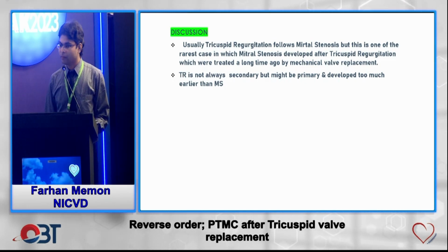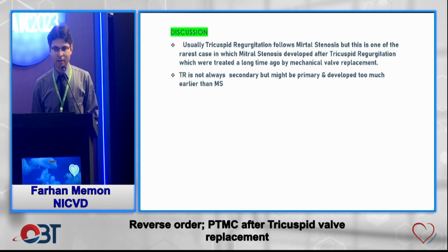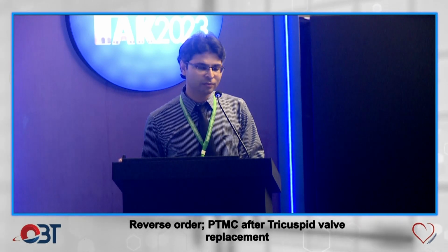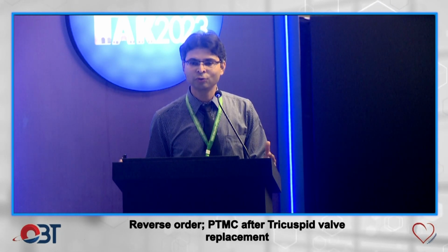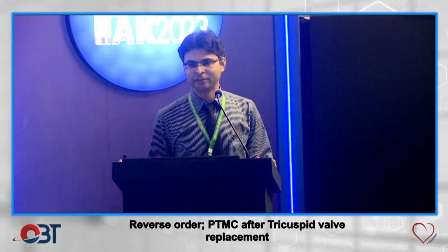इसमें मैं कहना चाहूँगा, इसकी सर्जरी क्यों नहीं करवाई? ऑलरेडी ट्राइकस्पिड वेल्व रिप्लेस में MVR करवा देते. Patient was 60 years old and already the patient has had a surgery, and redo surgery in that case is very high risk. So always use the low risk option rather than considering the high risk option in that case.